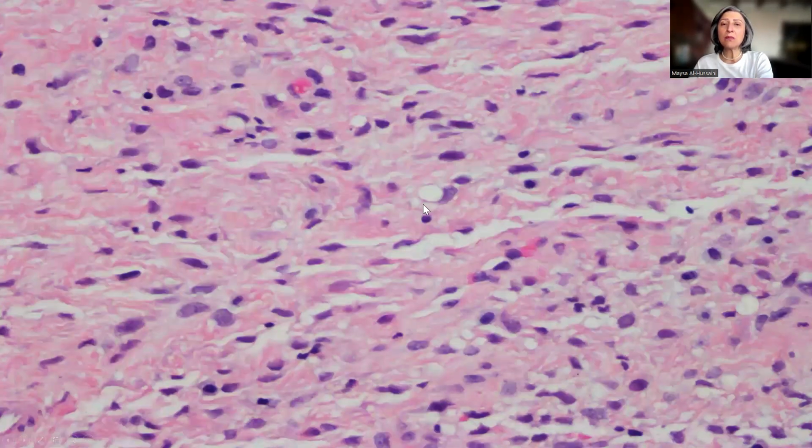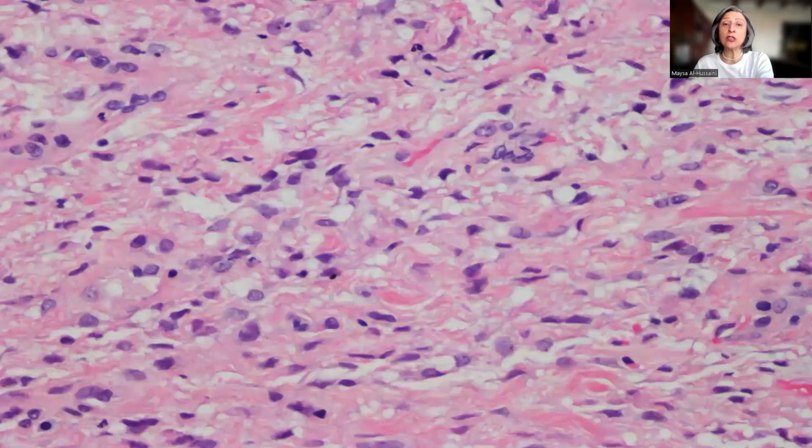background. Sometimes you might encounter what looks like lipoblasts, or a fatty component can also be encountered in some of the described cases. And here again, the appearance of the lesion: collagenous stroma, scattered cells with the stellate appearance and spindle cell appearance, and the collagen again here, some minimal pleomorphism, but definitely no necrosis and no mitotic activity.